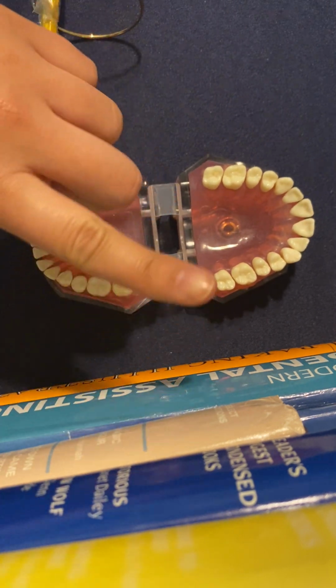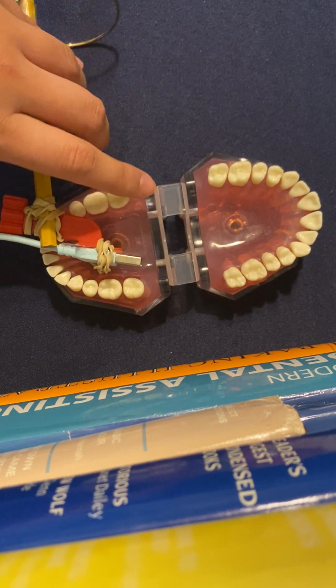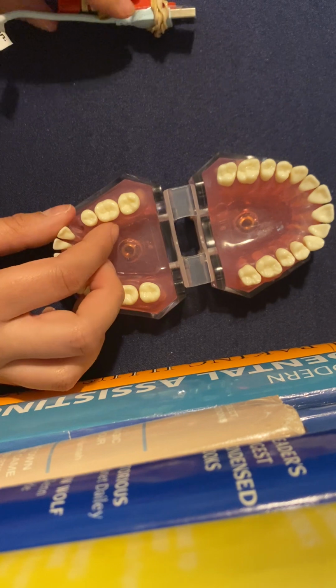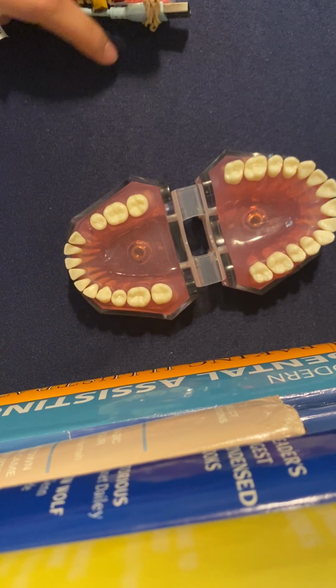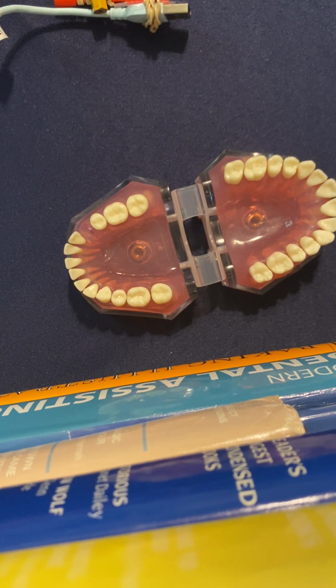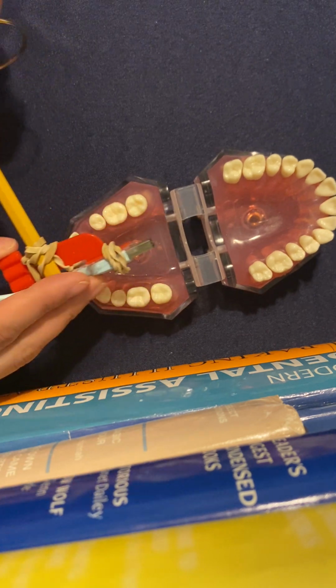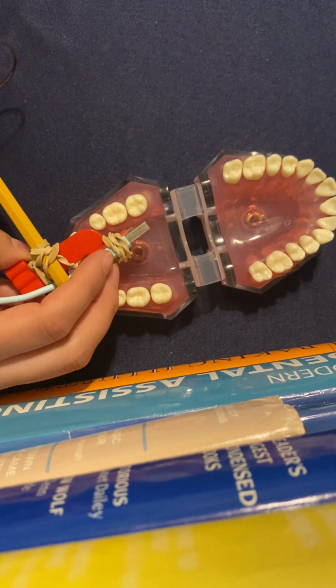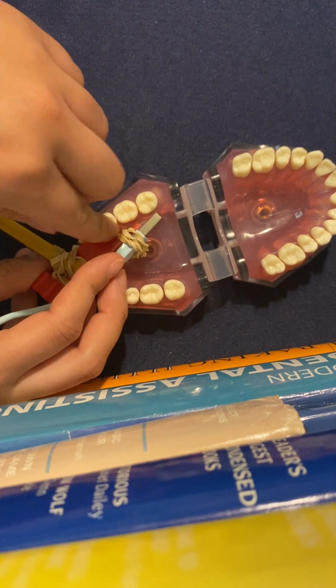All right. So number 1, got the bitewings, one set up. We're going to do the premolars first. Premolars, so you're going to place the anterior edge at the midline of the mandibular canine. That is a very weird way to say that, but I think what they're trying to say is you're going to want to put that between there.